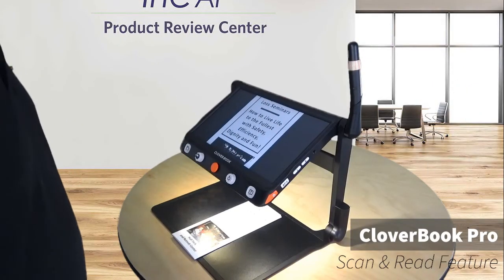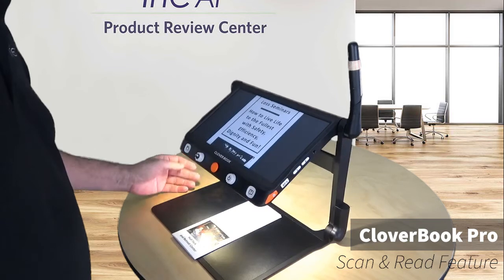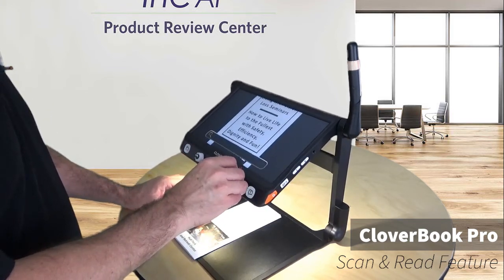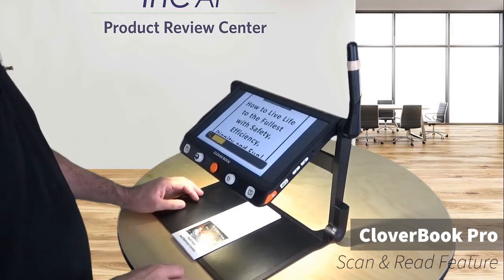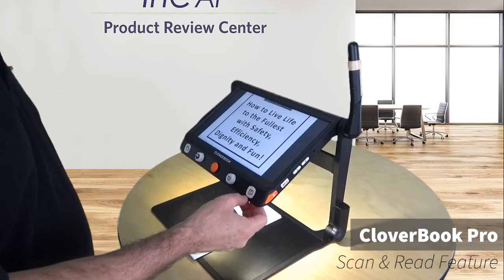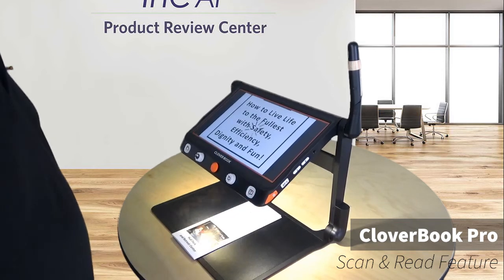Okay, so let's take a look at how the OCR works on this guy. So the CloverBook offers a couple different ways to do OCR. First of all, real easy, if I find some text that I want to have read to me, I just basically get it in view, and once I have the text that I think I want, on the right side of the front of the device there's a little recessed button with a T on it. I can press that. It's going to capture the text and read it back to me.